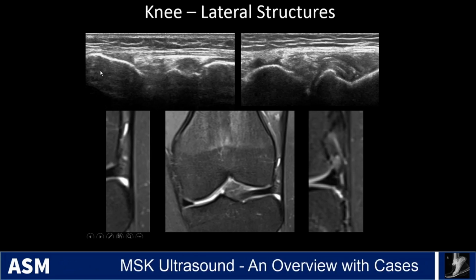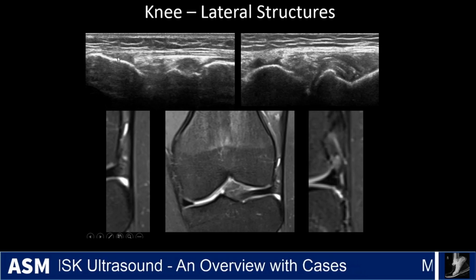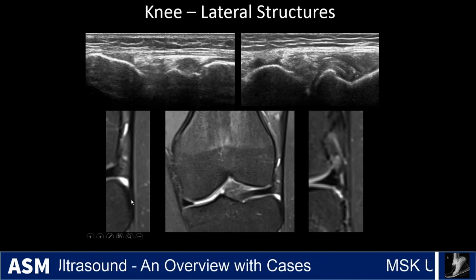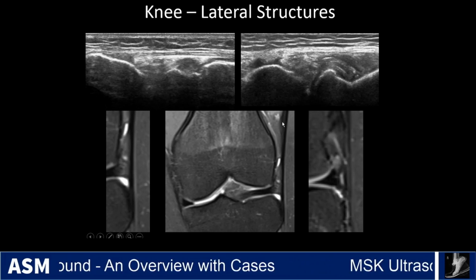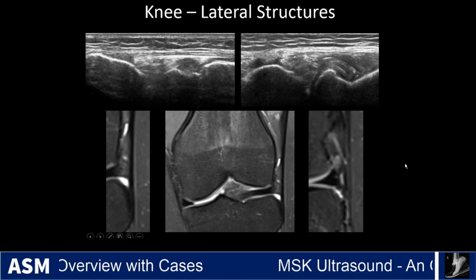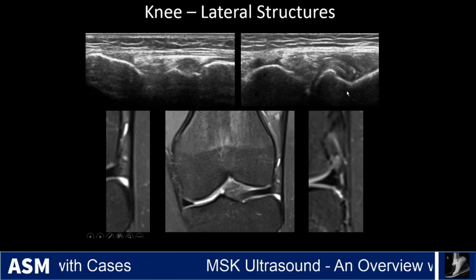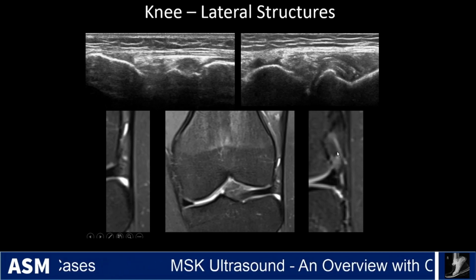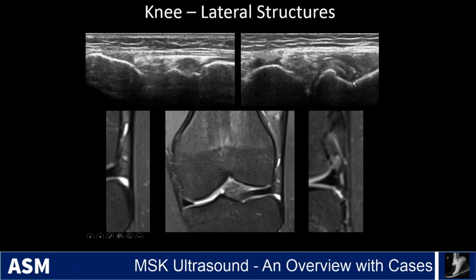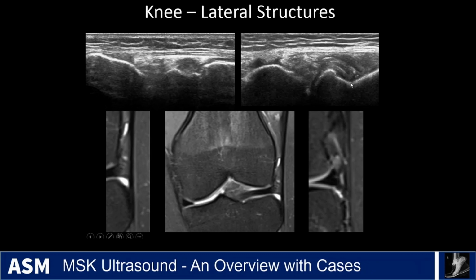So this is the femur here, the tibia down here, and this is the iliotibial band coming down to Gerdy's tubercle, and that's this right here. And then as we scoot further back, so I just blew up these images as we're coming from anterior to posterior, and on the next slide even further posterior. And you see the little notch where the popliteus tendon is going to be coming in. And in this case, you start to see it coming in, but it's actually attaching here. So it's looping around the popliteal hiatus to insert on the femur here.